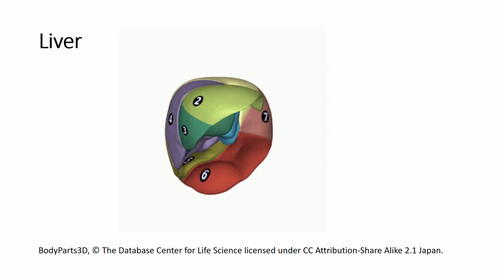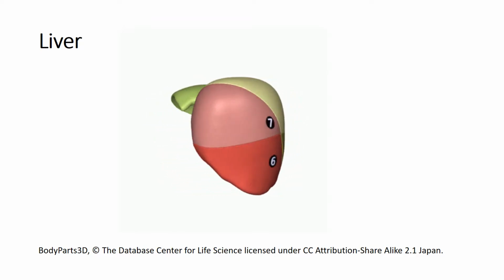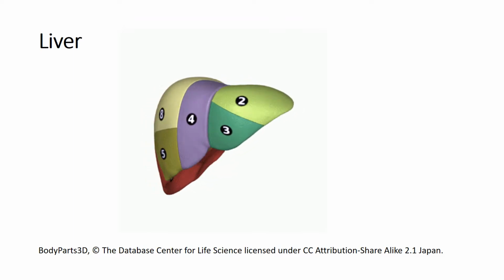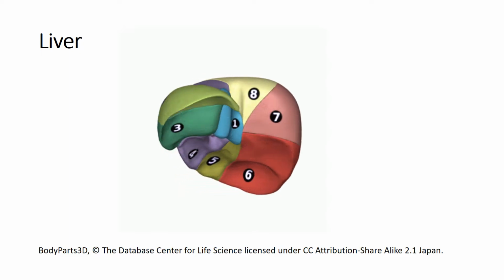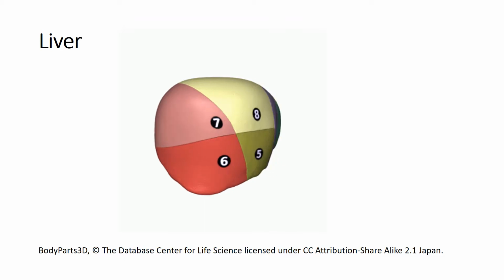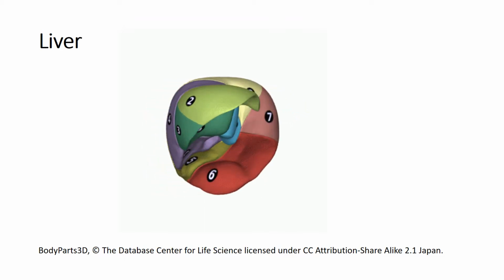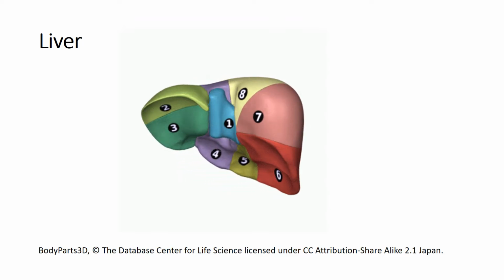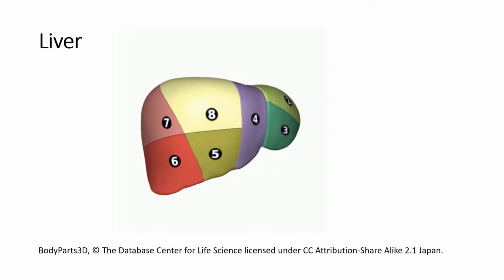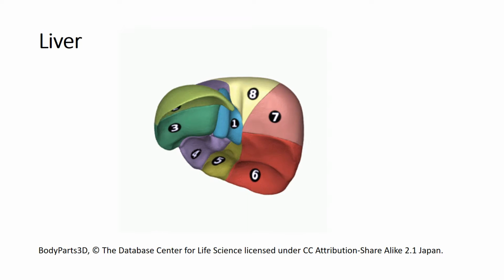So let's start with the liver and a quick summary of the various anatomical segments. Now, if you're like me, this sort of diagram will send shivers down your spine. Anatomy strikes again. I've got to say that knowing the distribution of the segments isn't crucial for the exam, but I thought I'd at least share a few things that I, possibly embarrassingly, only learnt while I was studying for the second part. The clockwise numbering system probably won't be news for many, but for me, I never knew the significance of the segments or how to place them in the setting of a CT scan.